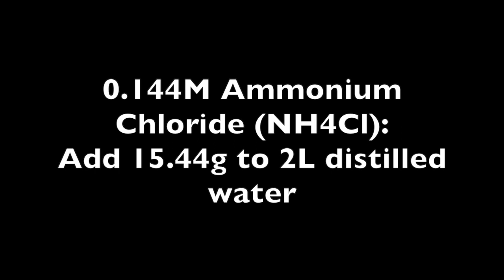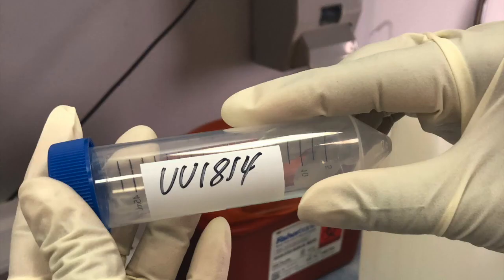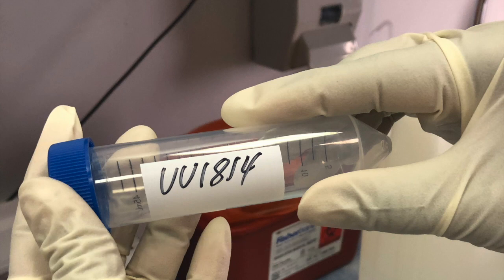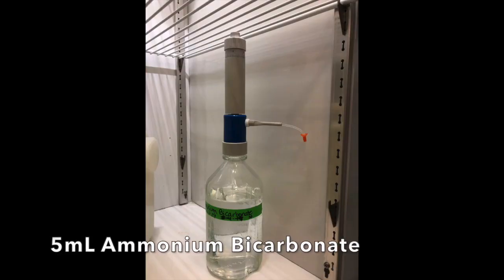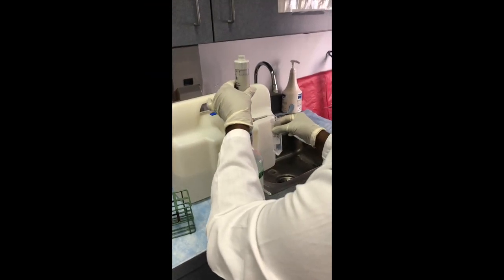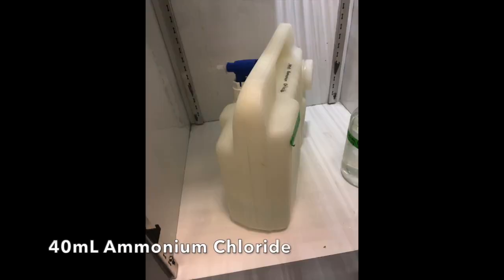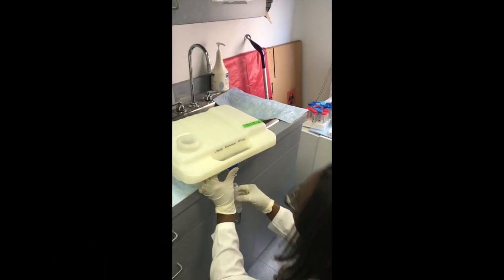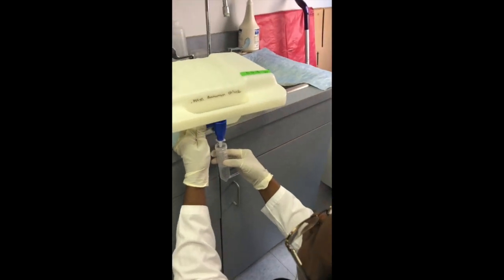These can be pre-made and stored in the cold room. Alternatively, they may be purchased, but if you choose this option, ensure that the molarity is as described. The ammonium bicarbonate and ammonium chloride will be combined in a labeled 50 milliliter conical tube, seen here. First, add the measured 5 milliliters ammonium bicarbonate to the conical tube. These containers can be purchased from Fisher Scientific. Then add the ammonium chloride, as shown here, to the 45 milliliter line in the conical tube.